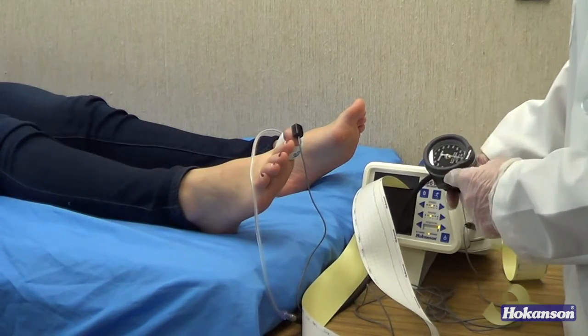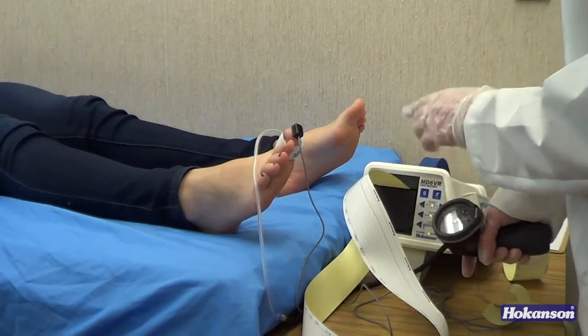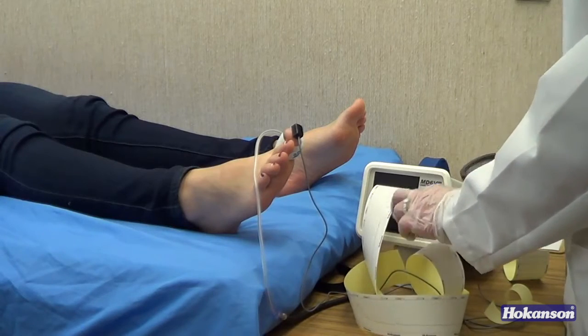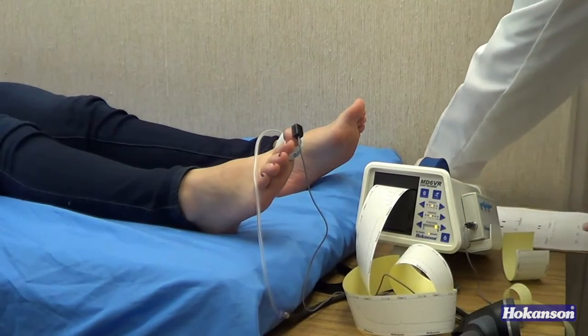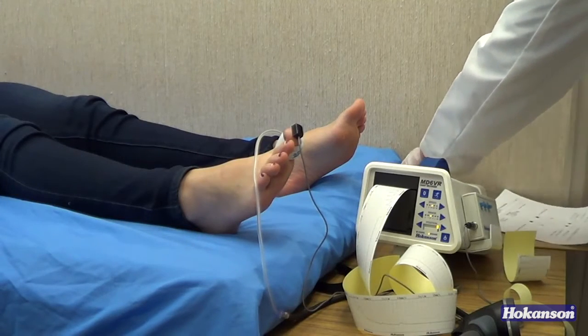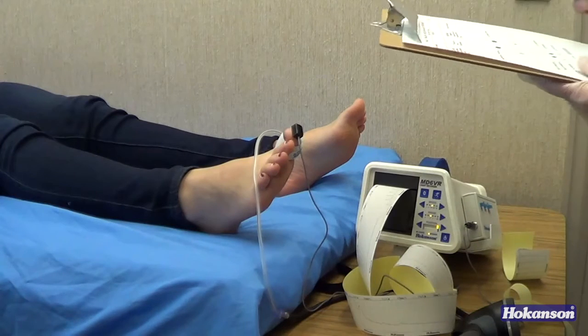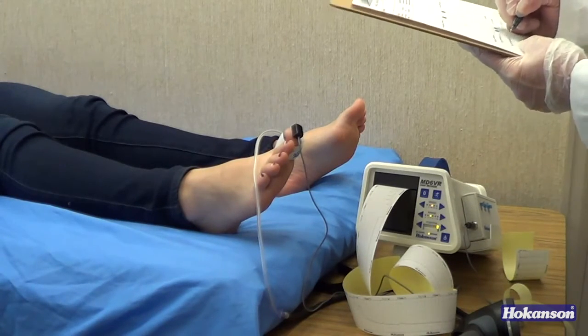Now that we've obtained the pressure, we can completely deflate the cuff and stop the chart recorder. We can see on the chart recorder that the patient's waveform has returned to normal now that the cuff is deflated, and we document the pressure on the patient's report form. So the pressure that we saw at the point when the pulse returned is the systolic blood pressure in the toe. That's 94 millimeters of mercury.